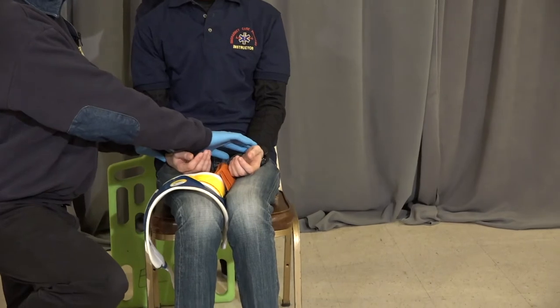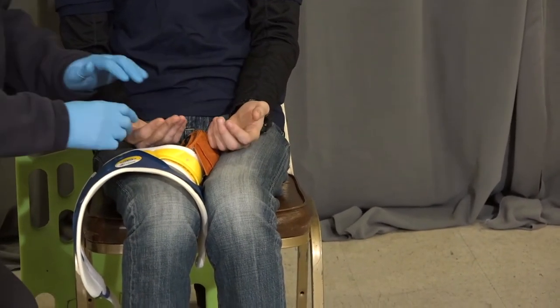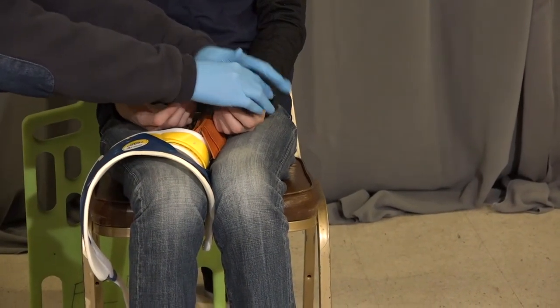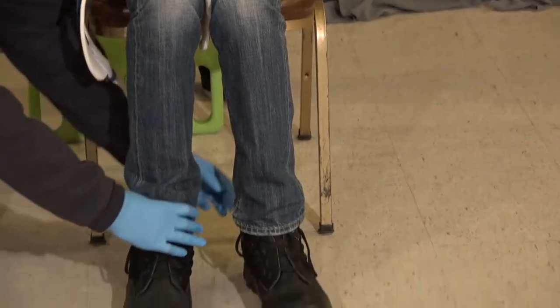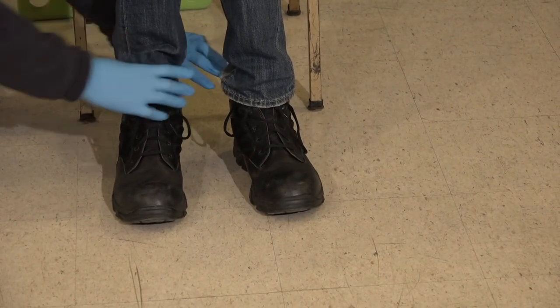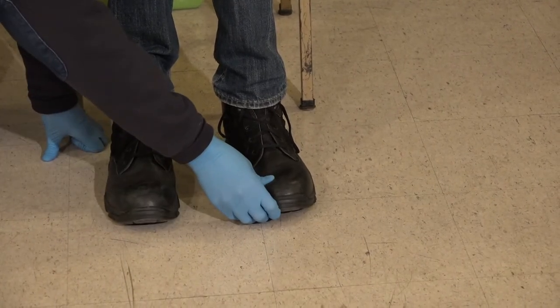Assessing distal pulses. Wiggle your fingers for me. Which finger am I touching? Which finger am I touching? Checking distal pulses. Wiggle your toes for me. Which toe am I touching? And on this foot, which toe? Take down.